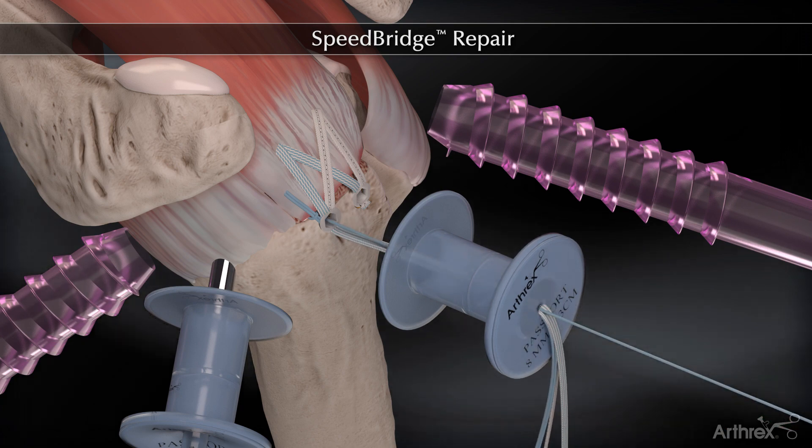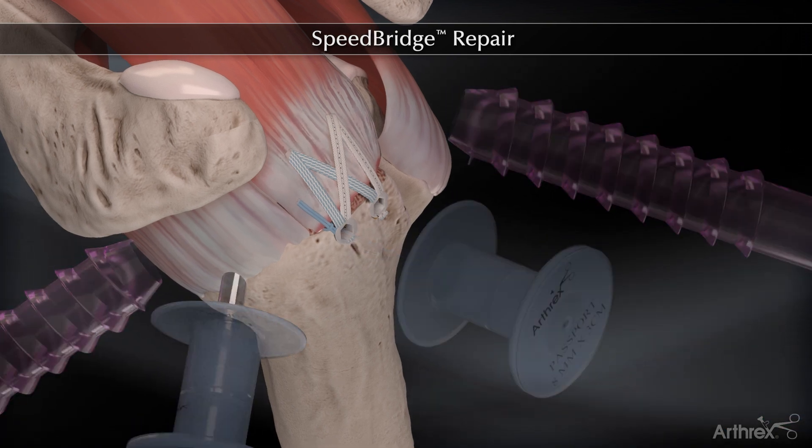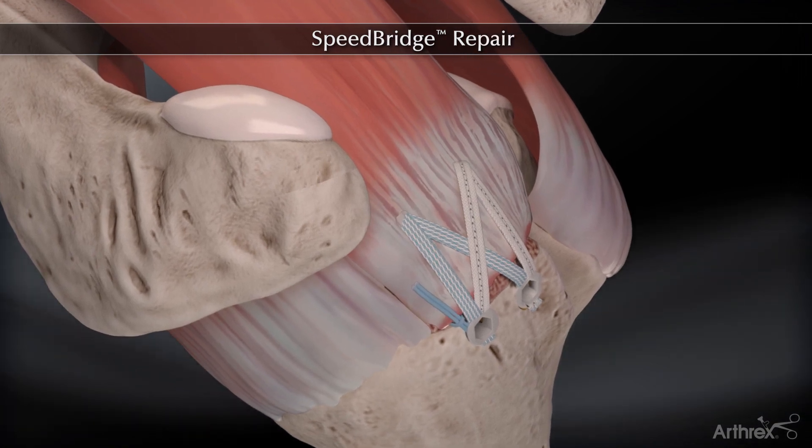This completes the totally knotless Speedbridge repair, which enhances footprint compression to maximize tendon to bone contact.